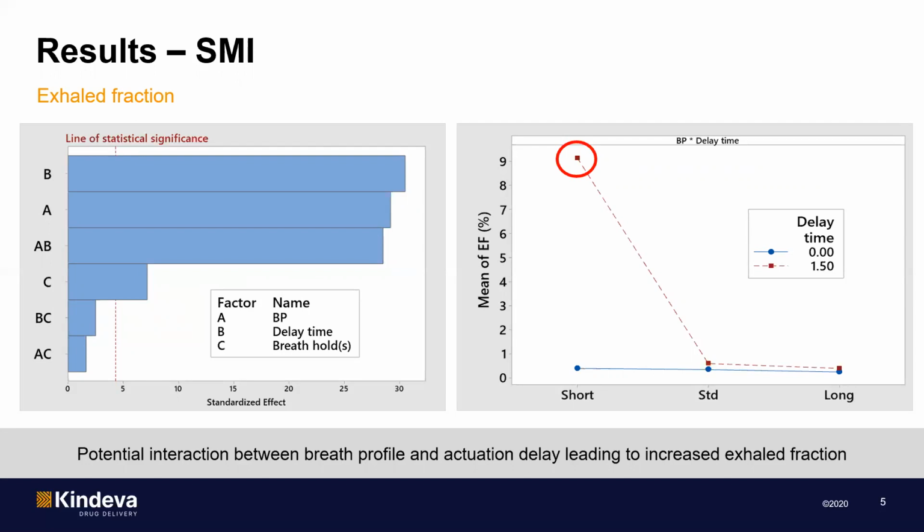This is an extreme case where the tail of the bolus is emitted very proximate to the end of the inhalation profile. Otherwise, the exhaled fractions simulated have been very low. We have, though, been unable to confirm the accuracy of these predictions, as there is no in vivo data available for this specific product.